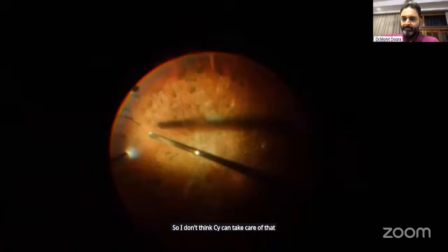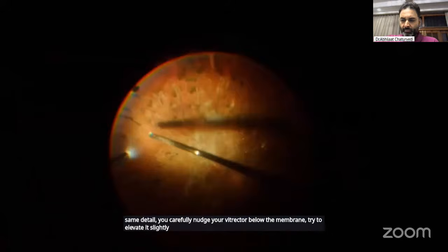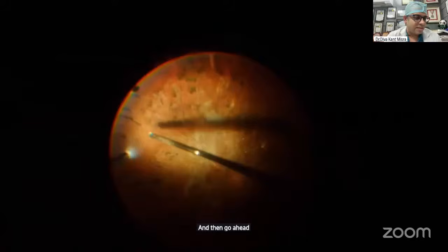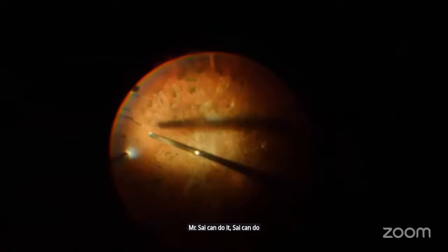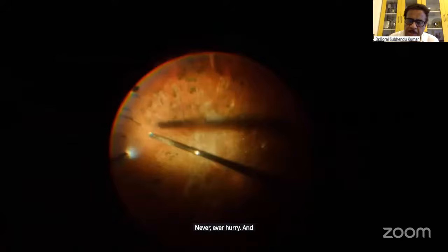Nudge your vitrector below the membrane, try to elevate it slightly, and then go ahead with your dissection. The dissection should be very careful. Your mind should act like a monk. Never ever hurry. And there's a temptation to just lift up the membrane whenever you see the membrane.